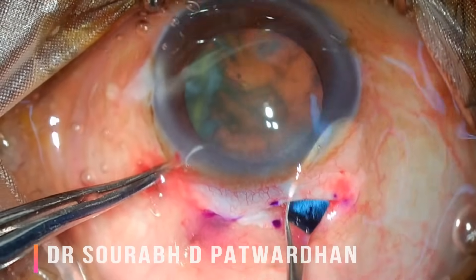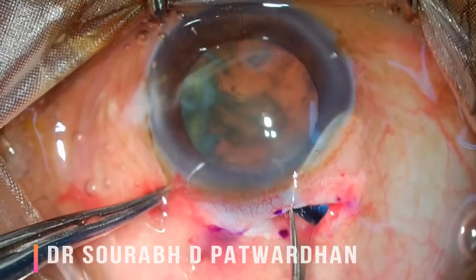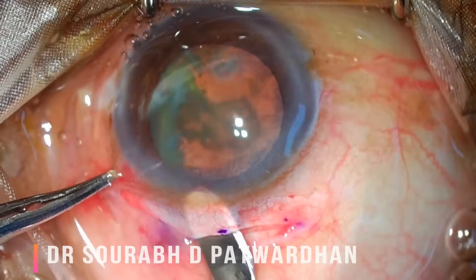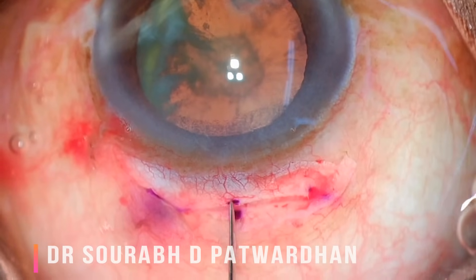These crescent movements are very important. Watch this video again and see how I am moving my crescent — I am always following the curvature of the sclera.